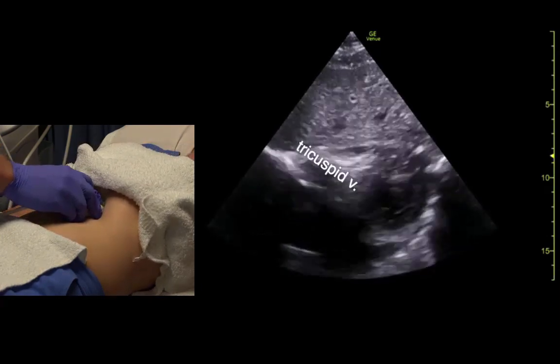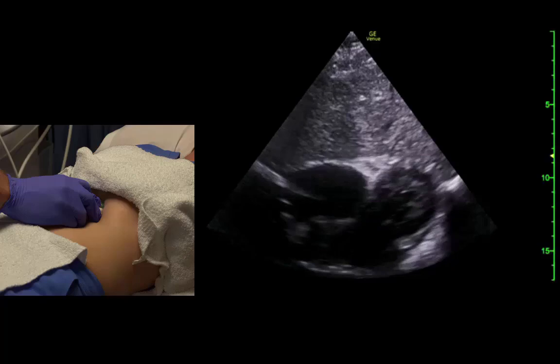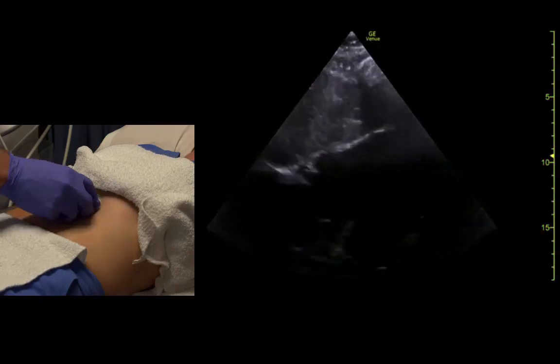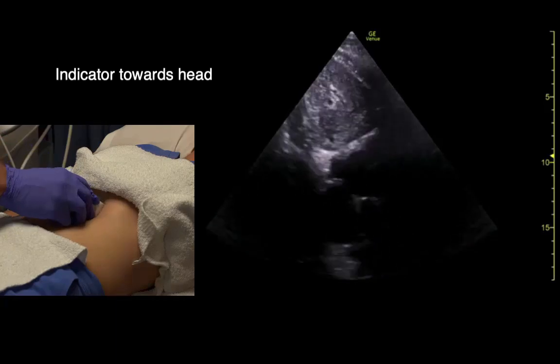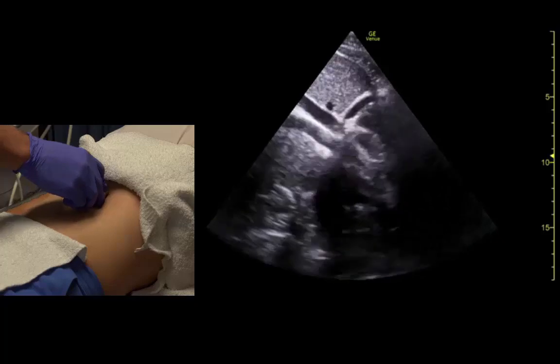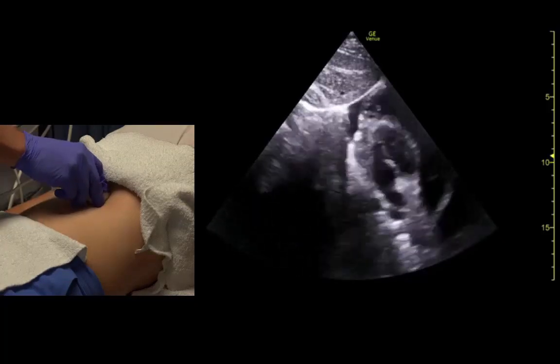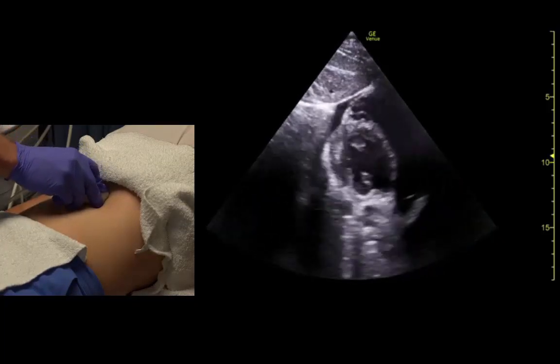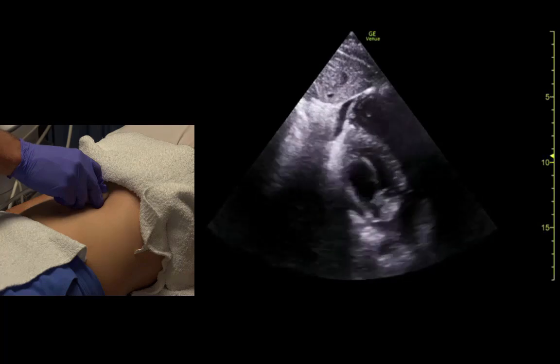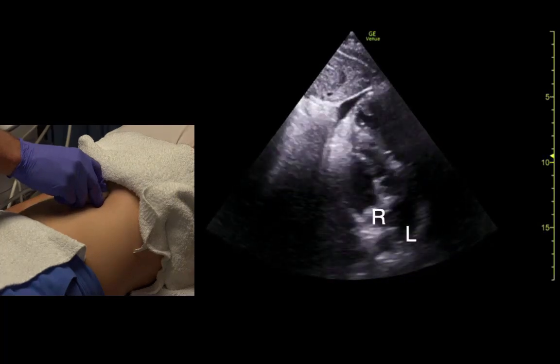We can really see the tricuspid valve well from here. In some patients who have a good sub-xiphoid window, we can get short axis views. With a big breath in, we can get a view where we see the pulmonic valve really well, and we can even see the right and left pulmonary artery branches from this position.